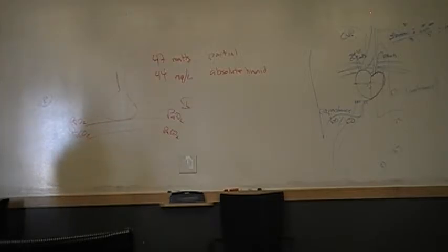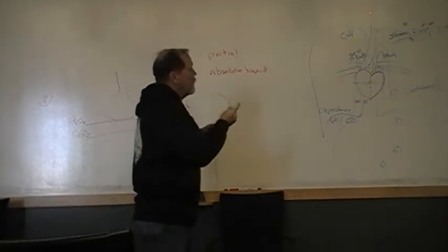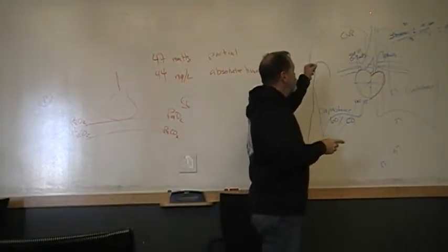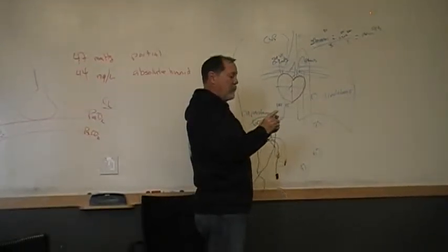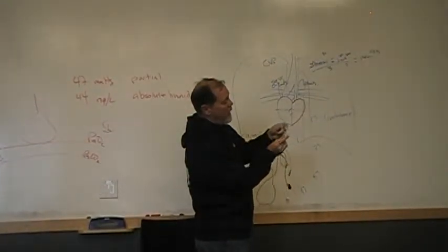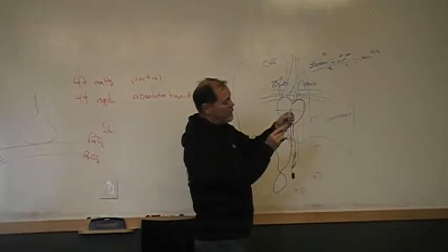Or through the groin too. It's a long enough catheter it can do it, but usually we go in through the superior part of the chest. So once it gets into the central circulation, we inflate the balloon 1.5 cc. So just 1.5 cc. That goes into the red port, and it says balloon on it.